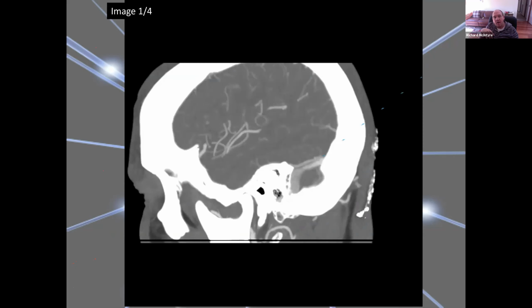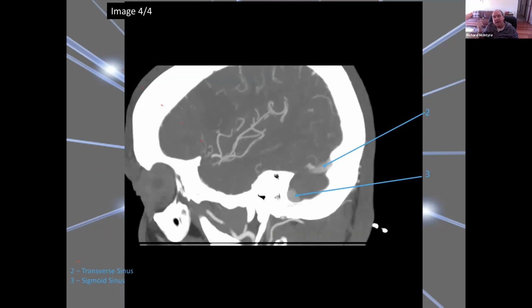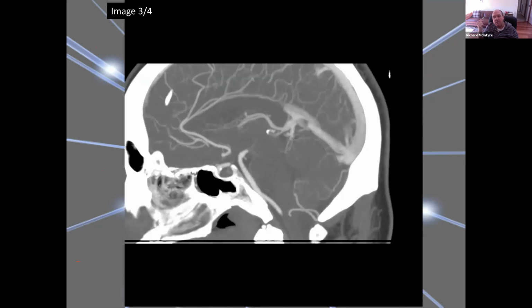Whereas MRI, and there's our detail from our CT scans. Okay, and the same sort of structures that we've done. Again, they're acquired axially, and then they're reformatted or post-processed to get their information.